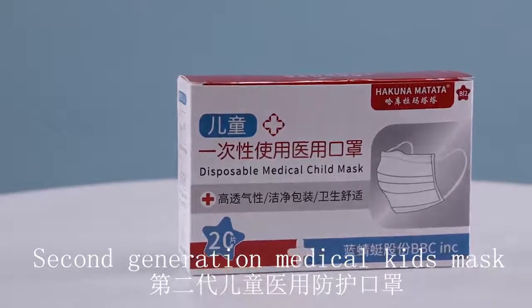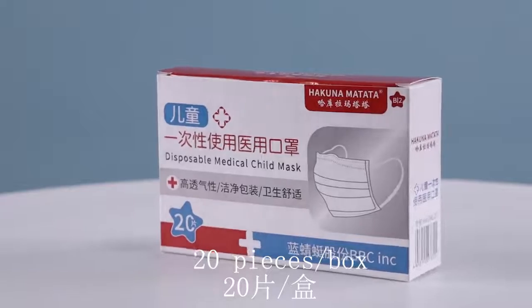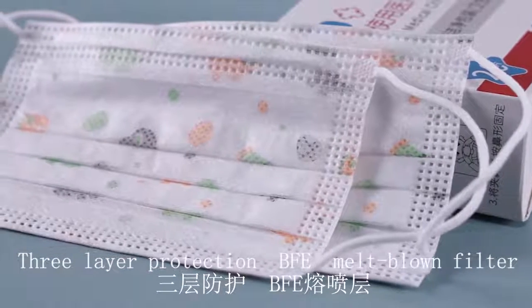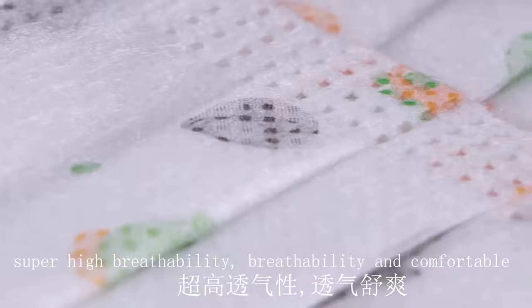Disposable face mask for a child to isolate contaminants, fit to the face. Built-in nose-bridge strip with adjustable curvature to fit the face more closely, to prevent pollutants from floating into the gap.